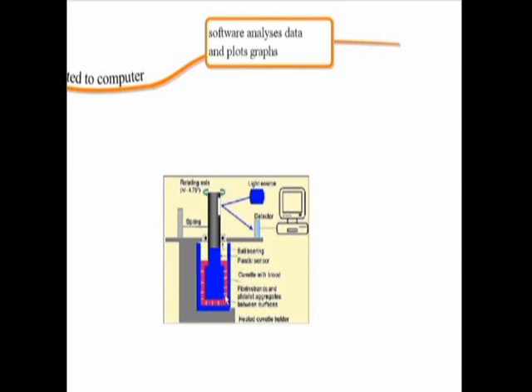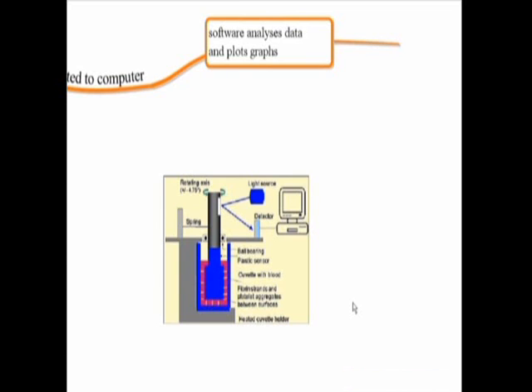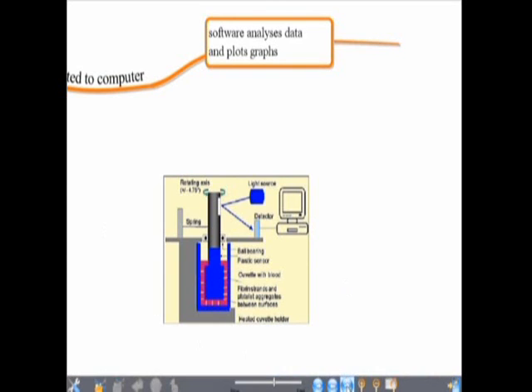This is live, whole blood. It hasn't been spun around in a centrifuge. It hasn't been messed about with. It's the blood straight from the patient. This is what the patient is. It's pretty much like a blood gas. It's fresh from the patient. It's like a real time indicator. That's the benefit of this machine.